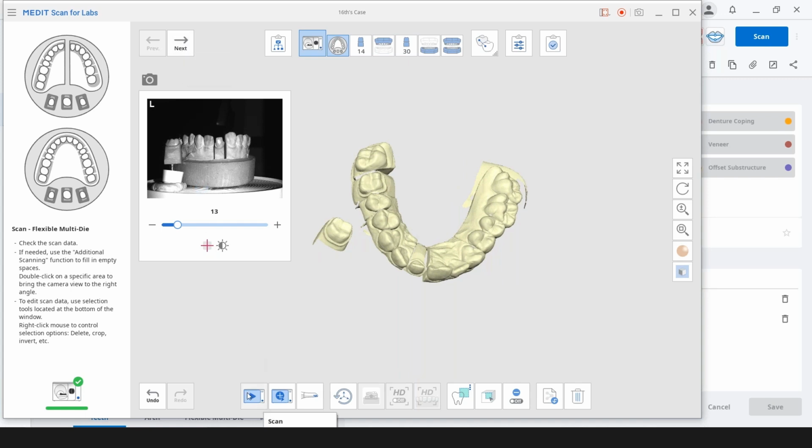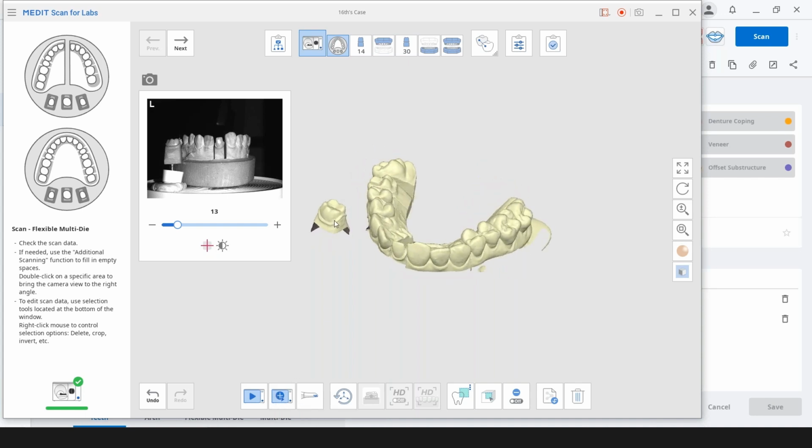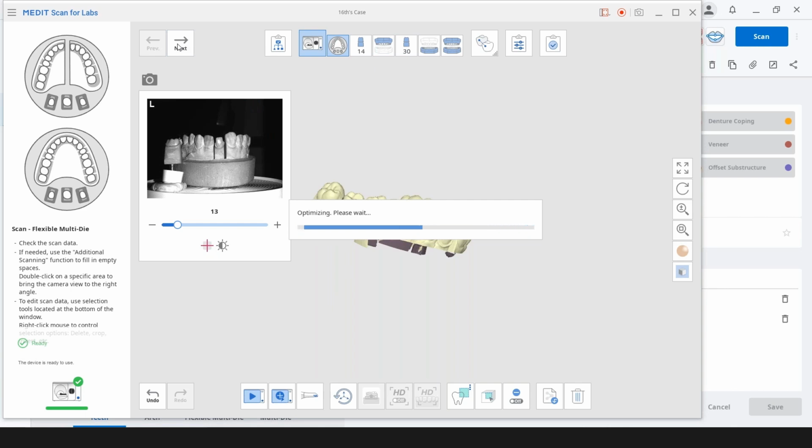I still only have scan and add a scan here. If I did see a hole, I could either double click on the hole and that will move the model to face the camera to take an extra picture, or I can just position it manually towards the camera lens like that and hit add scan. Okay, perfect. We'll go next. This will be the alignment stage.